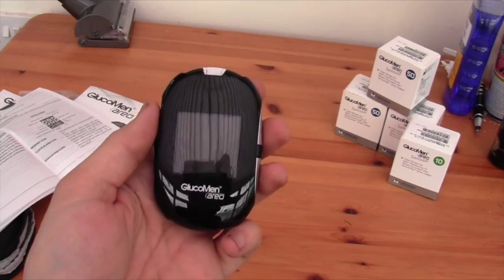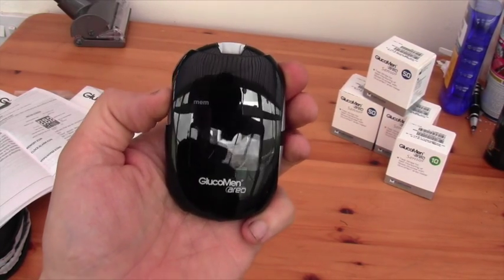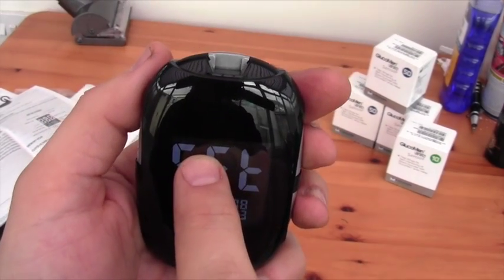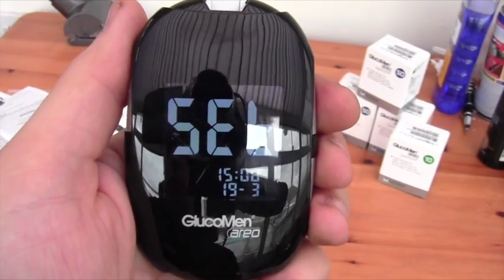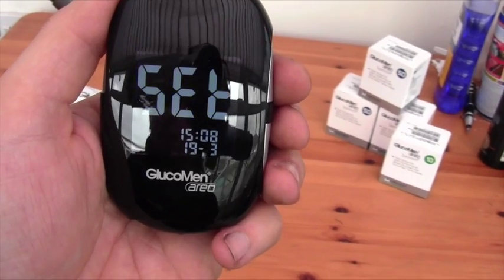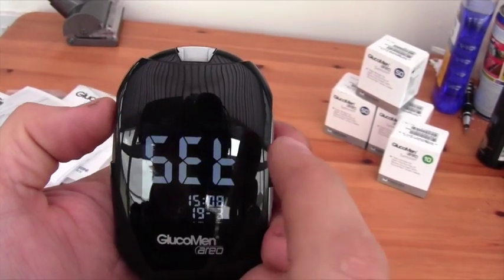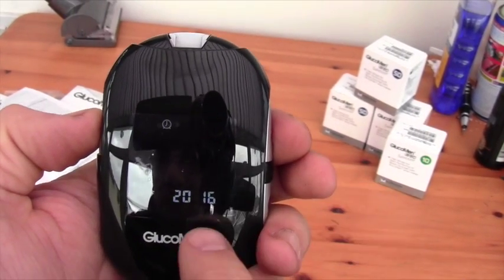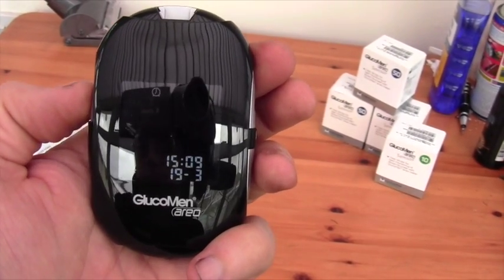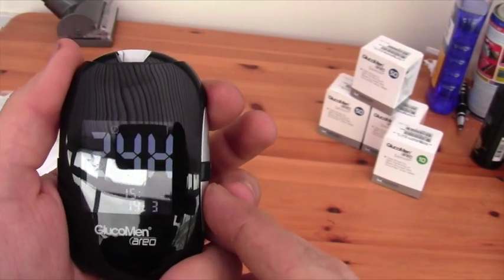One of the first things you'll want to do when you get any meter is check that the date and time is correct. On this meter you press and hold the power button on the side. The meter will start up and say 'set'. You can use the up and down arrows to go through and set the different things. At the moment the date and time is actually within two minutes of correct — just running two minutes fast. You go in on the time, which is flashing, to set the date and day and month, and you can choose between 24-hour and 12-hour, then go in and set the time.